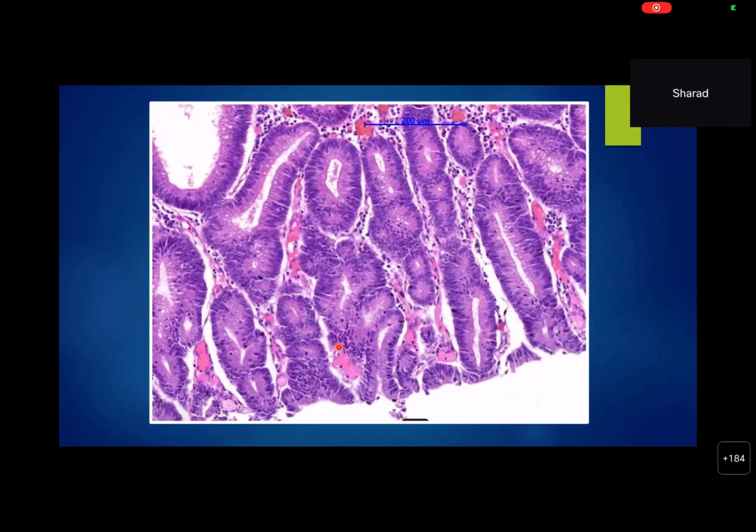So once you say dysplasia, what are you committing to? Epithelial. Epithelial can also be, sorry, tubular adenoma, epithelial. Yeah, adenoma. You know, the moment you say there is a dysplasia in an epithelial polyp, it becomes an adenoma. So that is the defining feature of an adenoma. An adenoma cannot exist without dysplasia. It is a complete paradox.